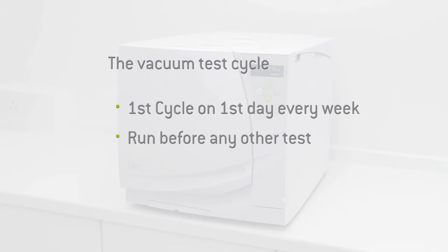The vacuum test cycle should be the first cycle performed on the first day of every week the steriliser is in operation. The vacuum test is to be run before any further daily testing, for example helix, or running a normal cycle.